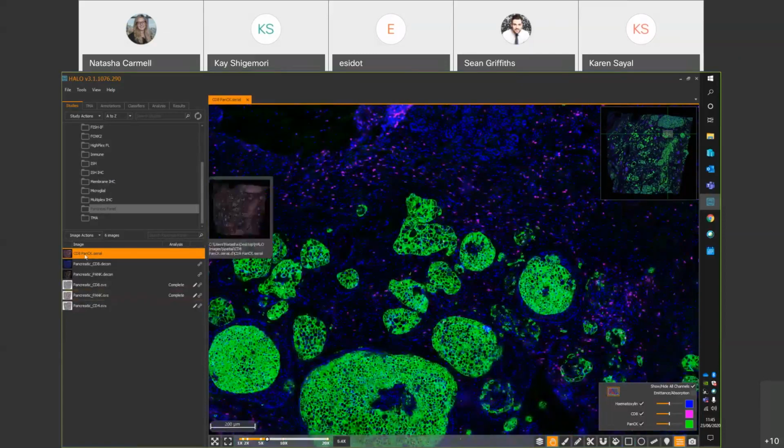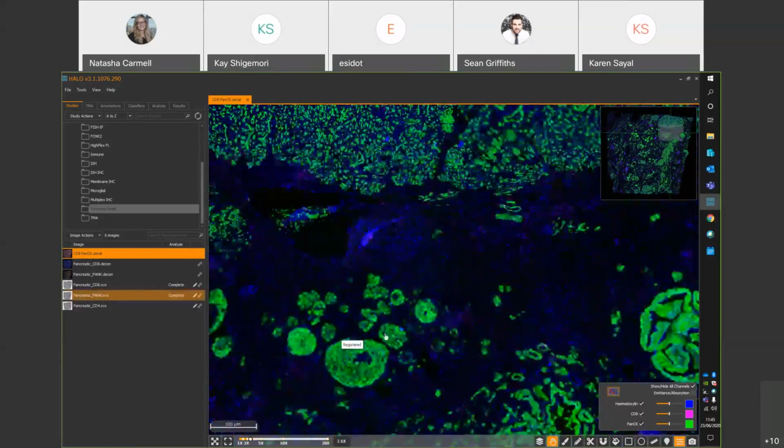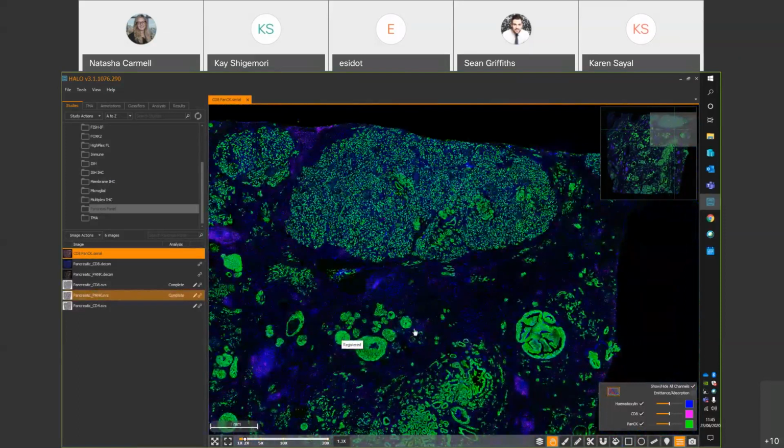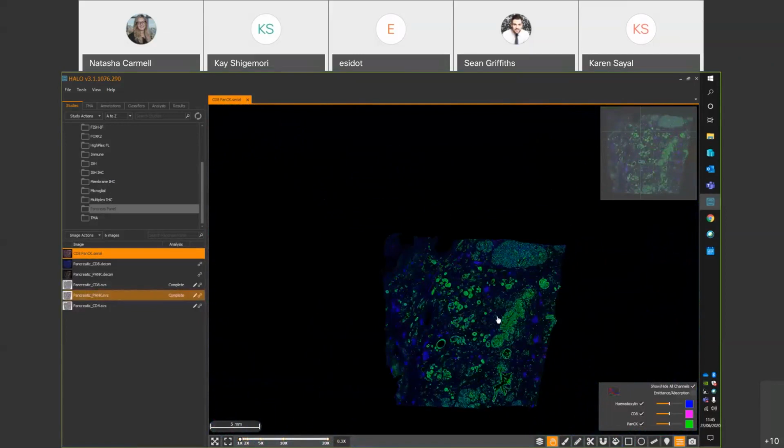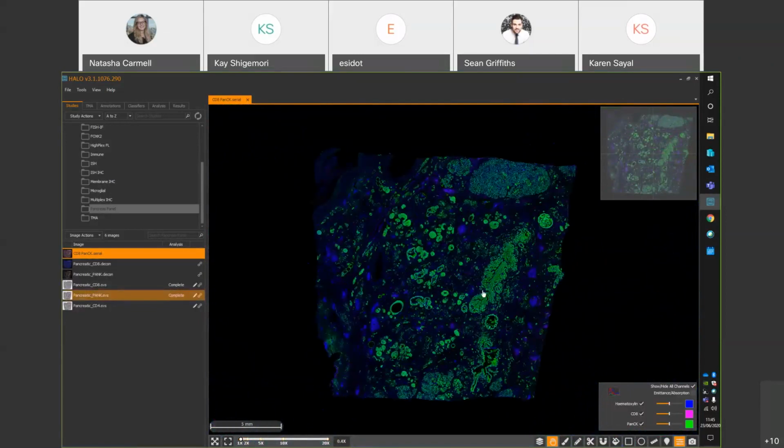And the serial image is really for you to check that you're 100% happy with registration before you go ahead and create the .tiff file, as the .tiff file will generally take quite a few minutes to generate as Halo's writing a whole new image. So the serial image isn't for you to analyze, so we wouldn't go into the Hyplex module now and perform analysis on the .serial image. That can cause problems with how long it actually takes to process and things. It's simply to check the registration, and I can't reinforce that enough.